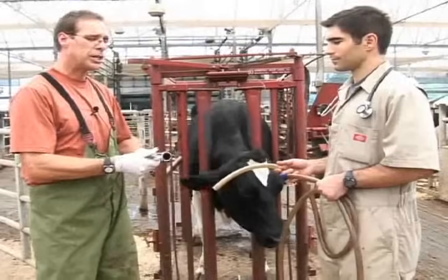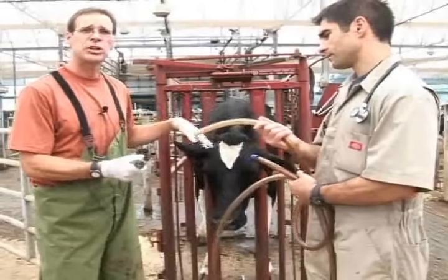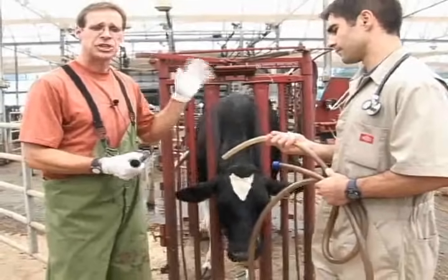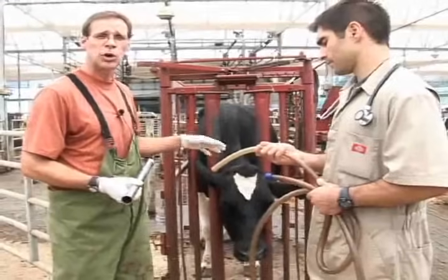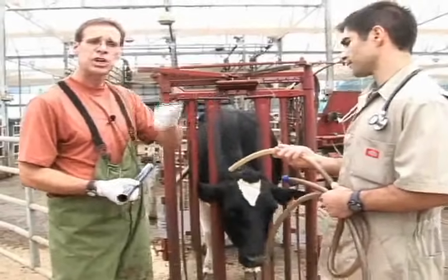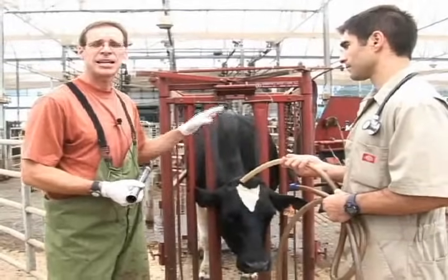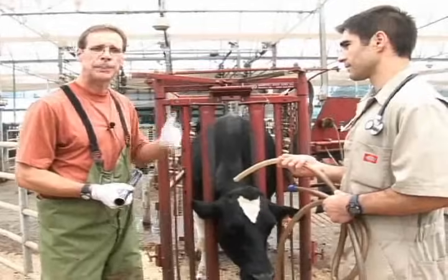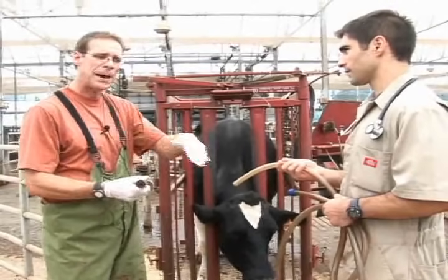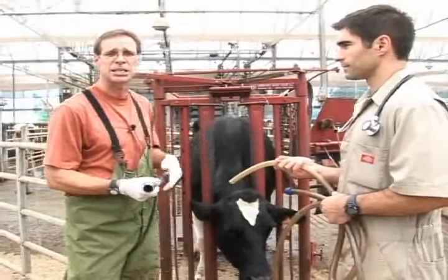The first checkpoint is whenever we pass this tube into the pharyngeal area of the mouth. The first thing to remember as a bovine veterinarian is that our cattle are indiscriminate eaters. Generally they will swallow more than 99% of anything placed into the pharyngeal area, so mostly when we pass this tube it will actually enter the esophagus and end up in the rumen.